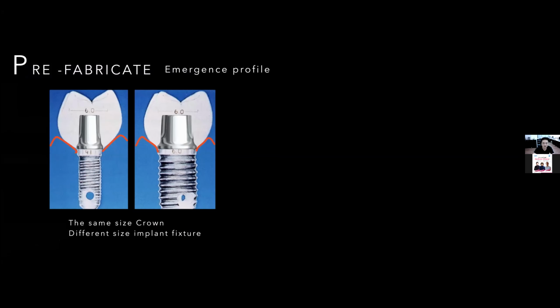And now we can think about what is interesting about the implant restoration. For a normal restoration, the patient's root and maybe the abutment are still very well in the bone, and maybe after the endo treatment, dentists can make the post core on the root. But if we want to create an implant restoration, we lose the root.